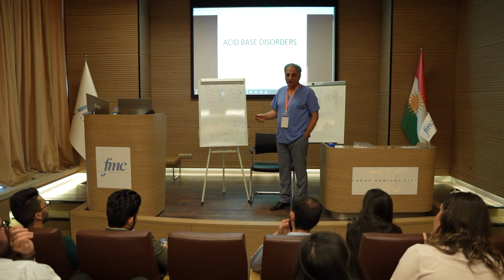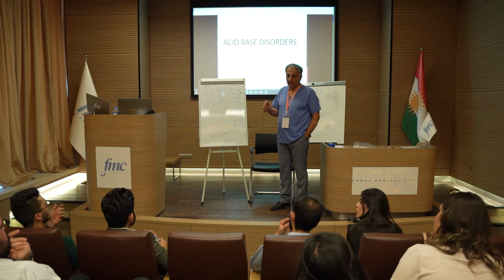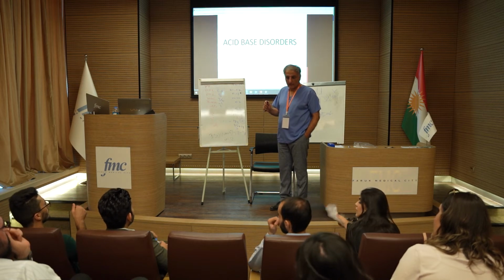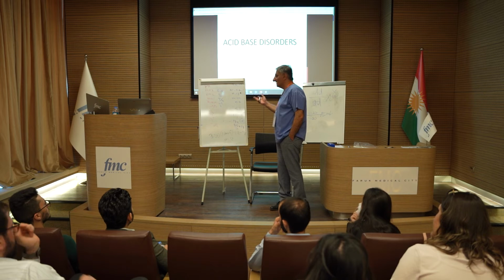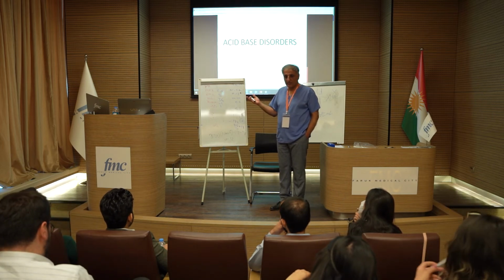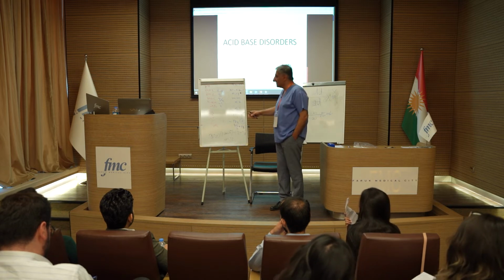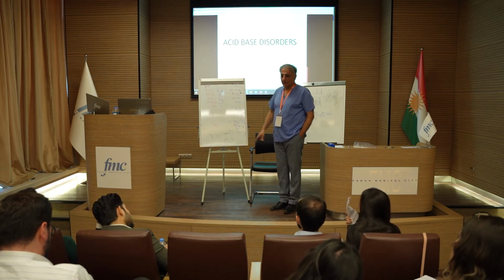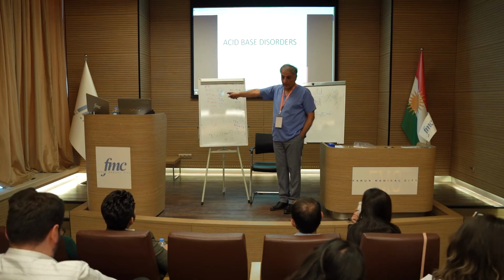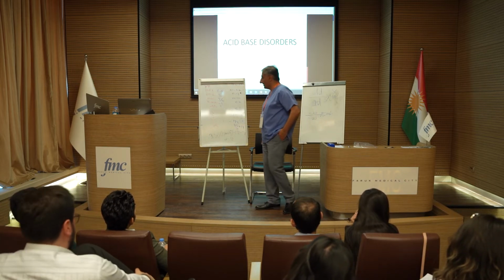What's the cause of confusion? Hypoxia or hypercapnia? Hypercapnia, because you don't expect her to have PO2 more than 8. But that's high CO2, which causes confusion.